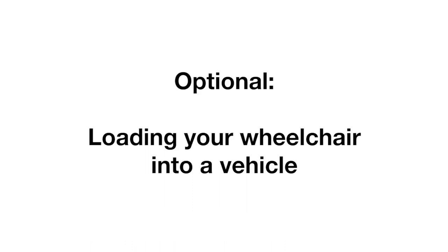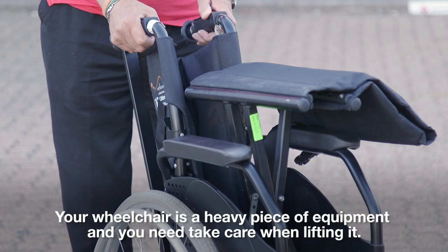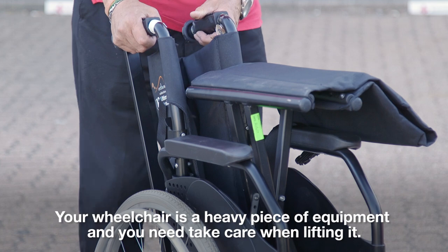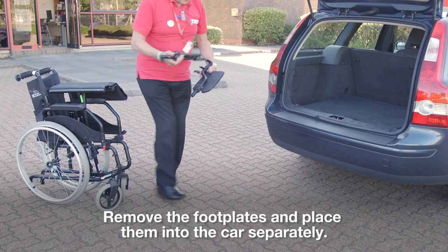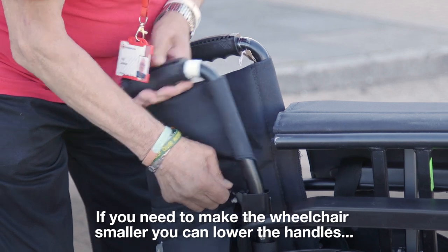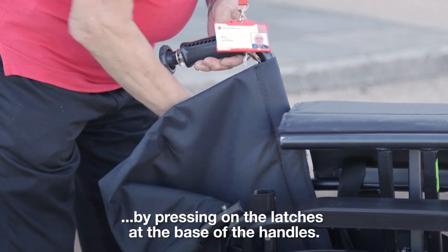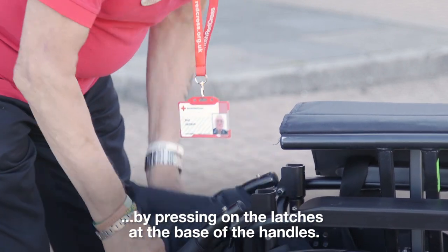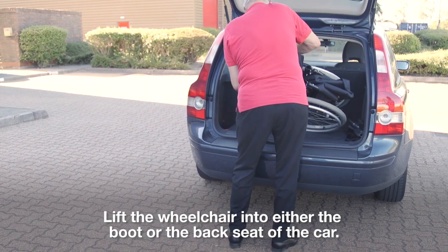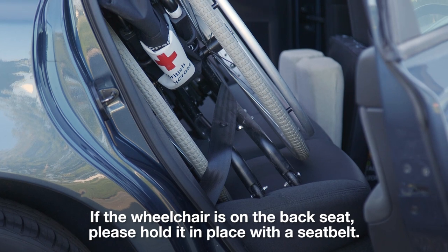Optional: loading your wheelchair into a vehicle. Your wheelchair is a heavy piece of equipment and you need to take care when lifting it. Remove the footplates and place them into the car separately. If you need to make the wheelchair smaller, you can lower the handles by pressing on the latches at the base of the handles. Lift the wheelchair into either the boot or the back seat of the car. If the wheelchair is on the back seat, please hold it in place with a seatbelt.